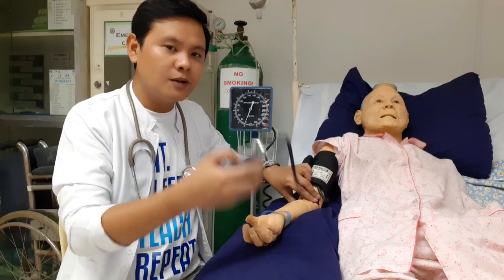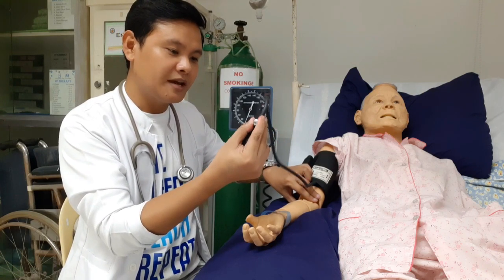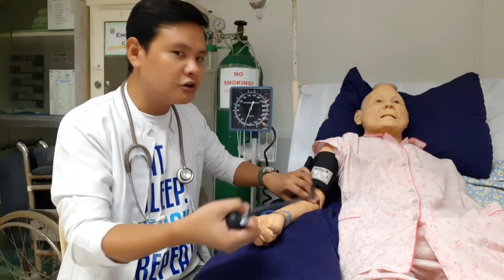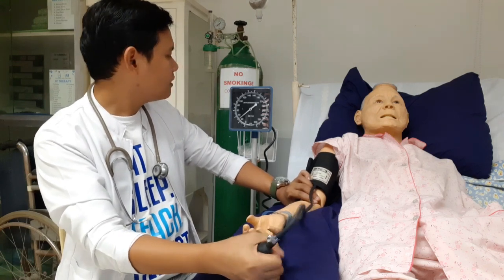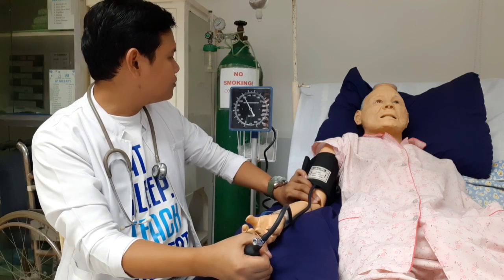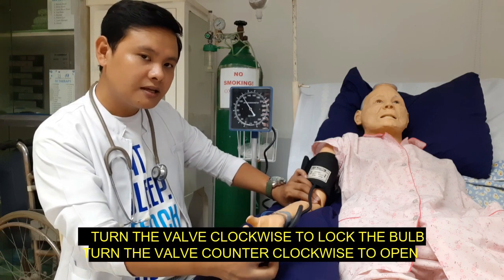Na-locate mo na. Next, you have to close the bulb of the pump by turning the knob clockwise. So, clockwise po tayo para ma-close natin ito. Okay, na-close ko na yung bulb natin. Next one, pump the cuff. Papump natin ito until we no longer feel the brachial pulse. So, let's try to pump this one. Naramdaman ko pa rin yung pulse. And then, pagdating sa may 120, hindi ko na nararamdaman yung pulse ng pasyente ko. So meaning to say, ang systolic most probably ng pasyente natin is nasa 120. That is the systolic pressure.